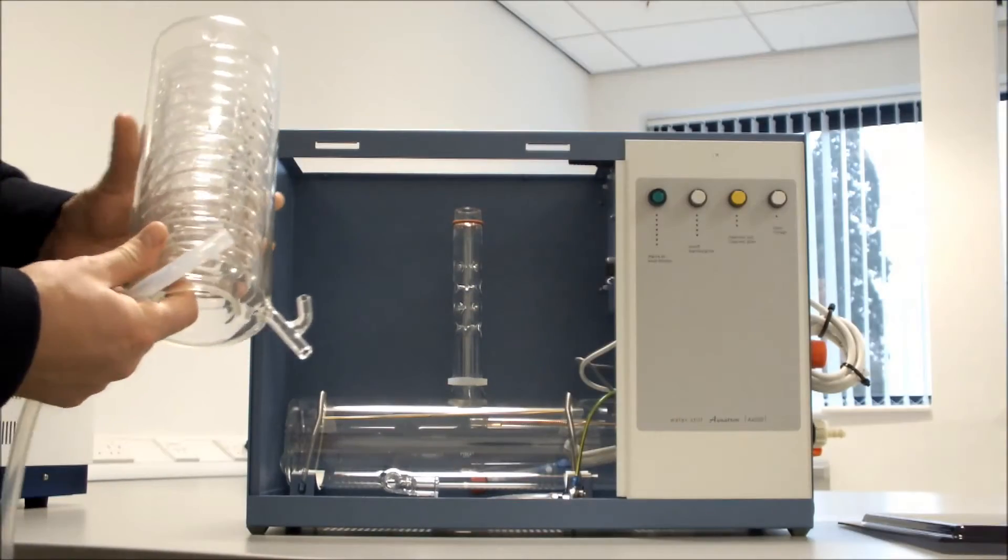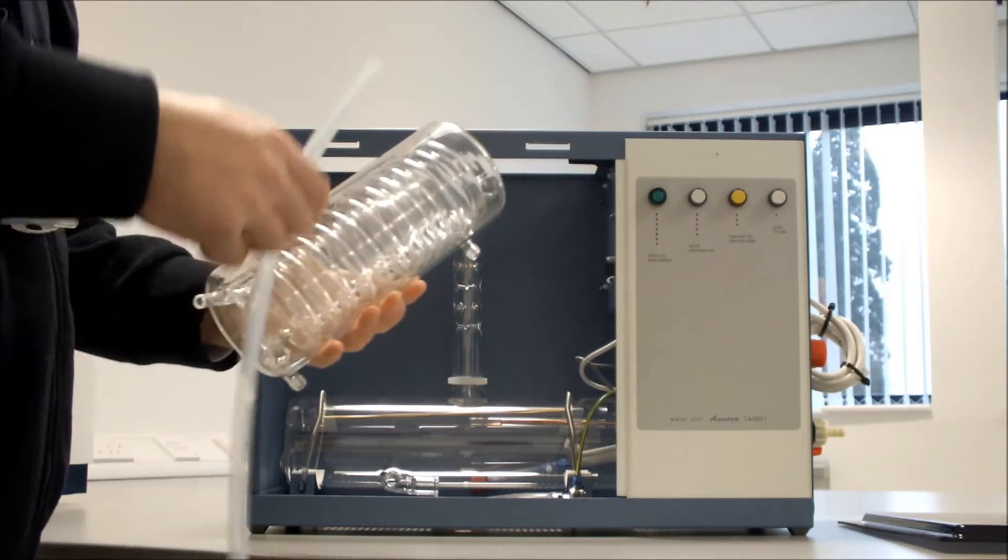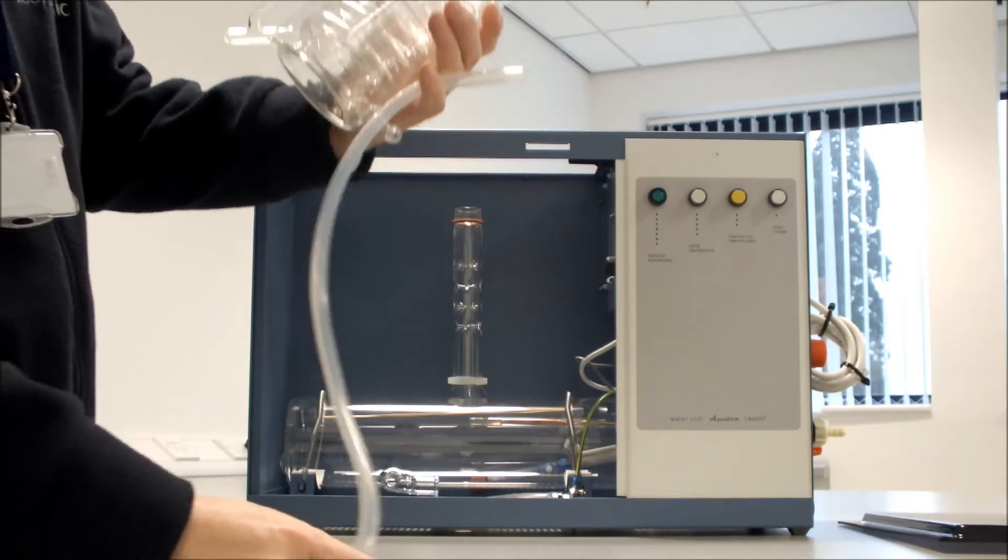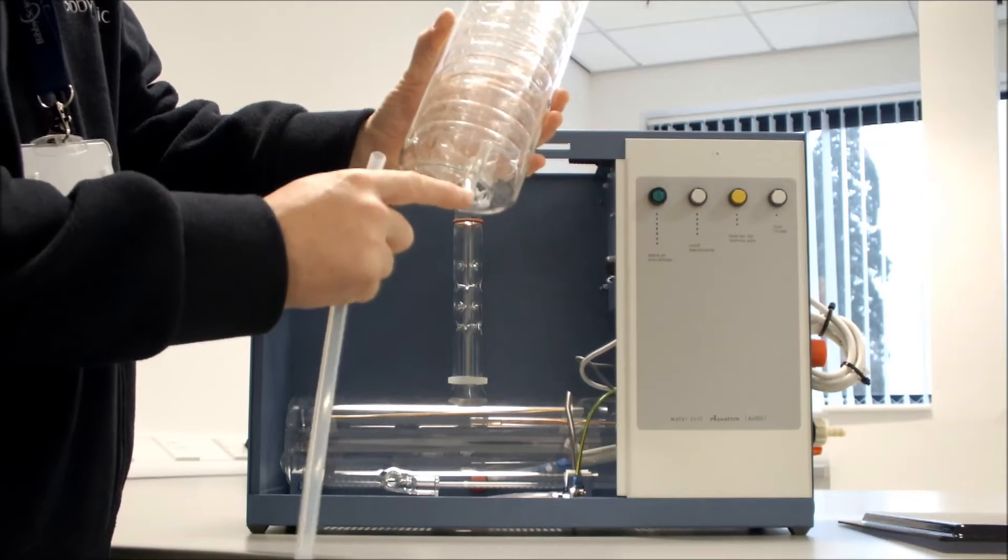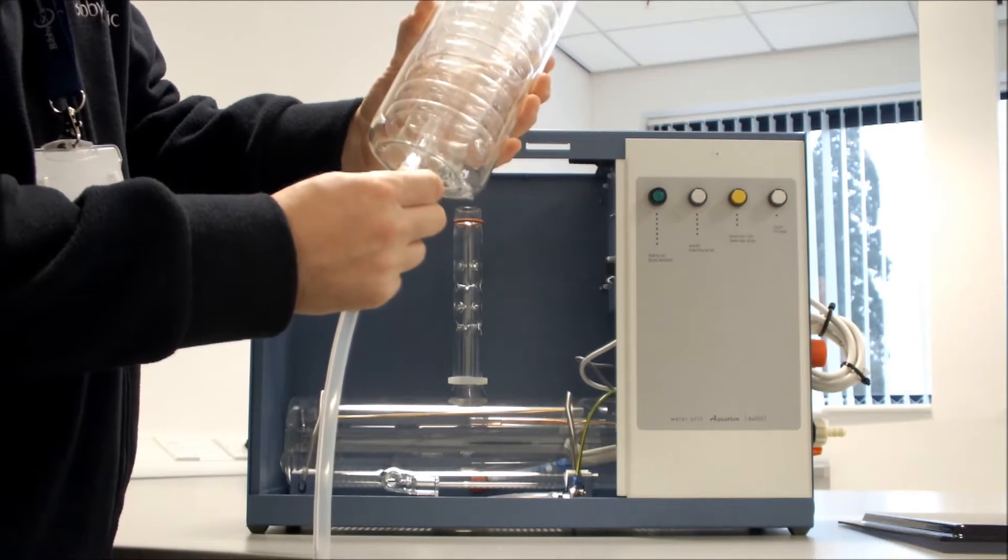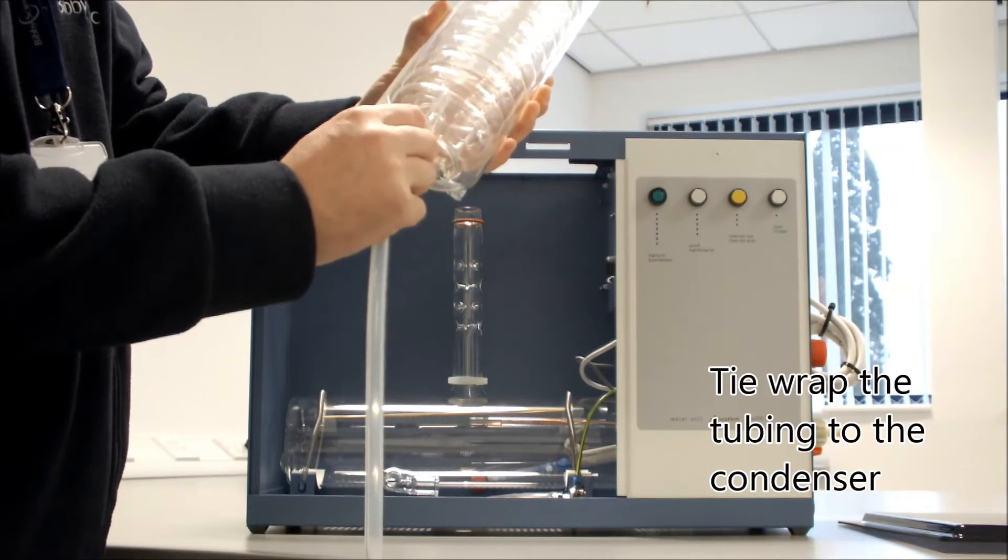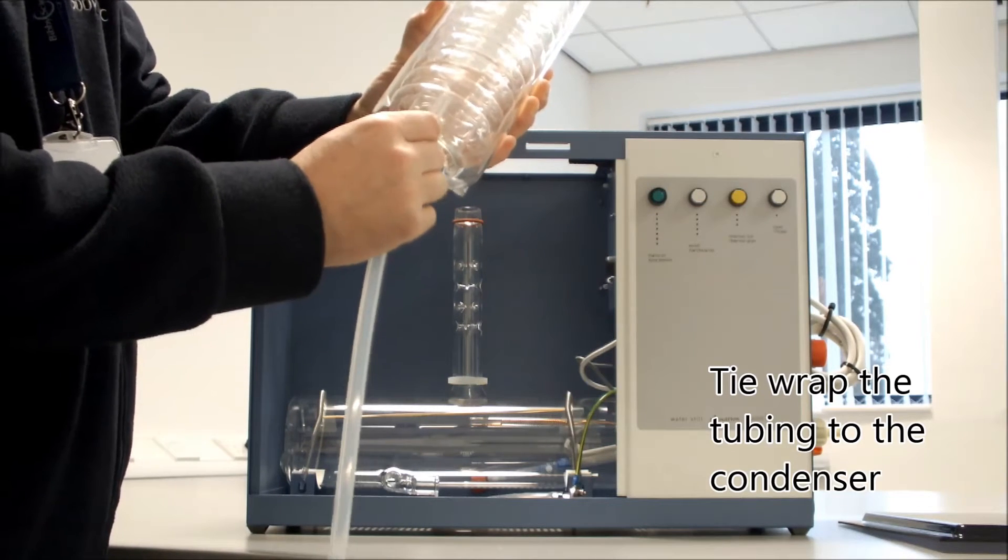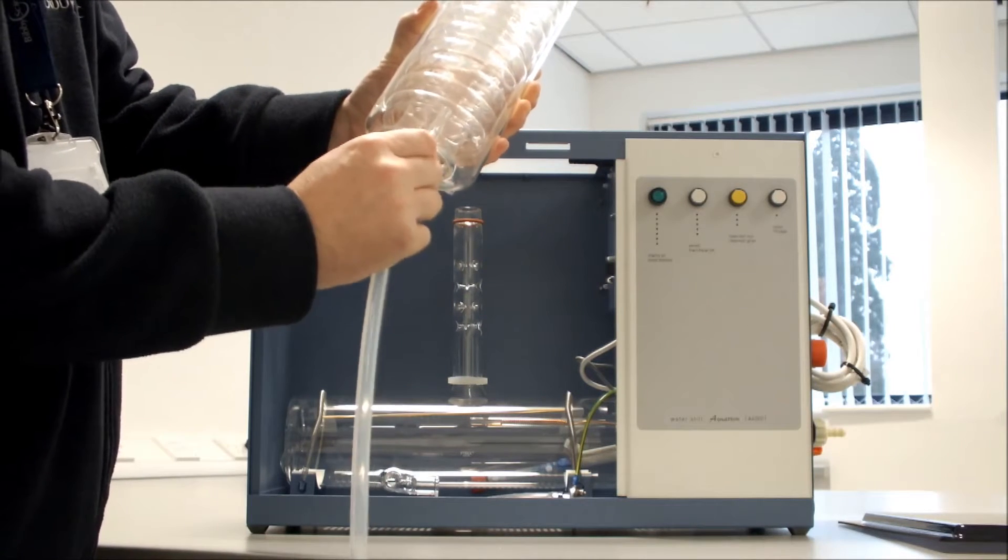The next thing to do is to fit the condenser itself. What we need to do is take our one meter of 8mm hose and connect that to the bottom connection of the condenser. This is where the distillate will actually leave the condenser. The tubing is just pushed onto the bottom connector.